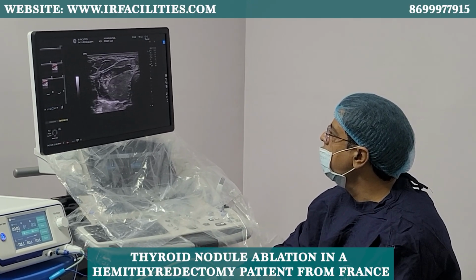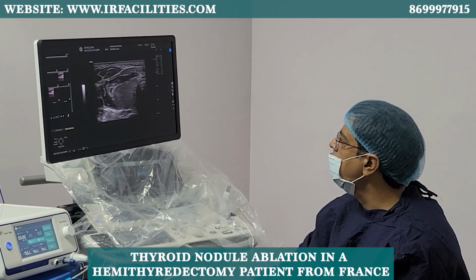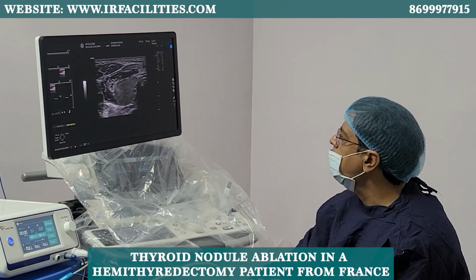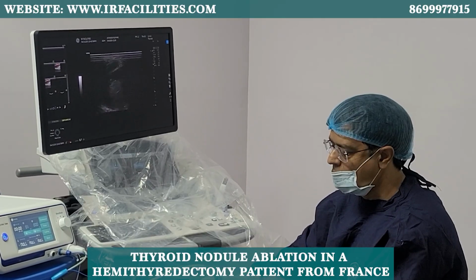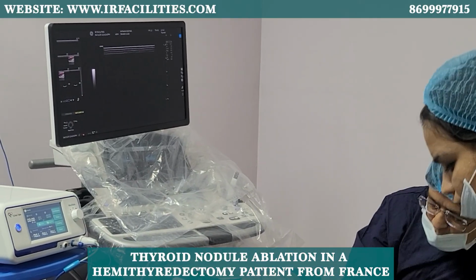Now I'm coming behind that. So you normally have a recurrent laryngeal nerve.